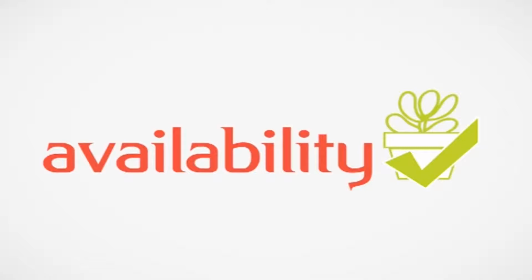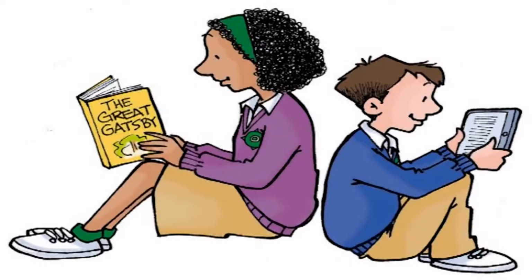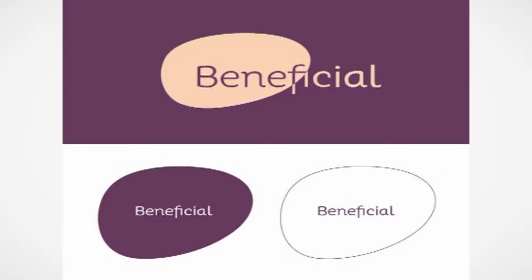Advantages of the spectacle magnifier: availability of a range of magnification. Both hands are free while using. Once used efficiently, they can be used for longer periods. Disadvantages of the spectacle magnifiers: exact reading distance is important. Short reading distance with high powered lenses. More fragile than magnifiers, which results in scratching or breaking. Good lighting is needed at a close distance. Often a reading stand is beneficial to bring material close.